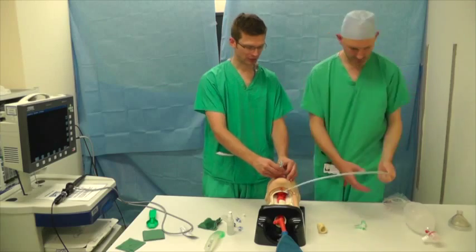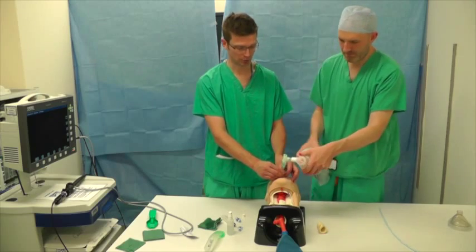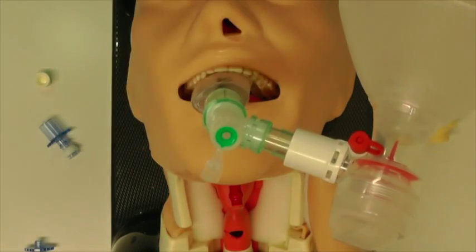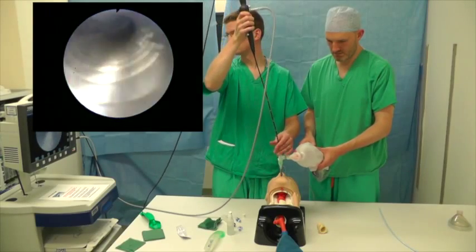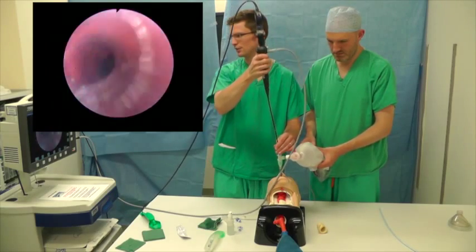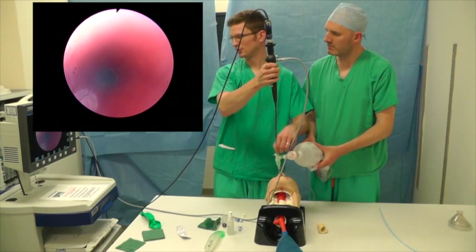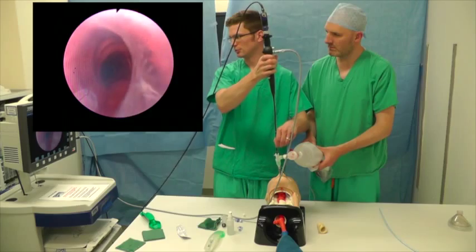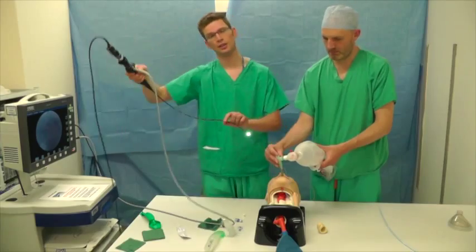We've inserted that to 25 centimetres — we're going to check we can ventilate and then check the position of the tube. We can ventilate nicely. Put the angle piece on to maintain ventilation, then pass the scope back through the tracheal tube right to the tip — you can see it's sitting above the carina. Go down as far as the carina, pinch the scope on the outside, and pull back until you see the tip of the ET tube — about 3 centimetres above the carina, which is absolutely fine. We can go ahead and get on with the case.